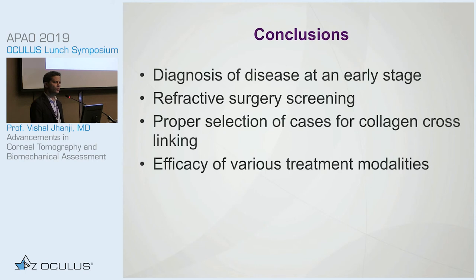We have a unit for refractive surgery screening. It doesn't sound very good when you have to cut down your number of cases based on the results of CBI. It does help us for proper selection of cases for collagen cross-linking. And we believe that it might have some role in looking at the efficacy of various treatment modalities, especially collagen cross-linking, in the future.